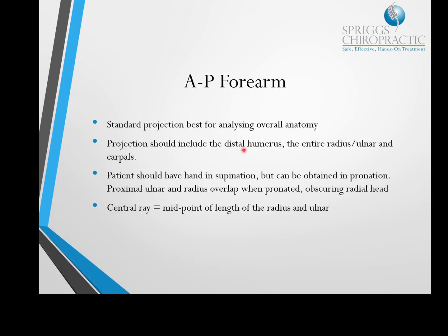including the distal humerus, is important because you can have supracondylar fractures of the humerus, obviously the distal humerus, the elbow end, or you can have fracture and dislocation of the radial head, the olecranon, things like this, of the ulna. So this is why this is a very common projection that's done in A&E. And with that mechanism of injury, it's to be able to rule out injuries at both ends, and then if you find an injury at either end, you'll then do a hand and wrist, or you'll do an elbow to fully assess the main injured sites, whether that's the wrist, the elbow, or both.